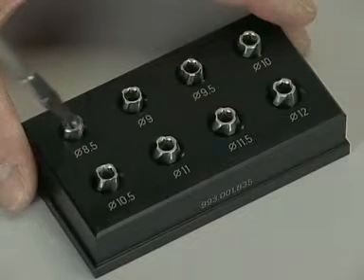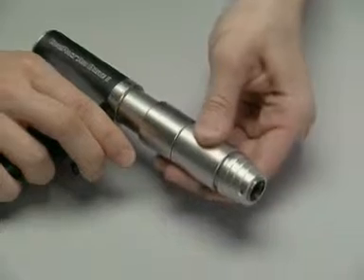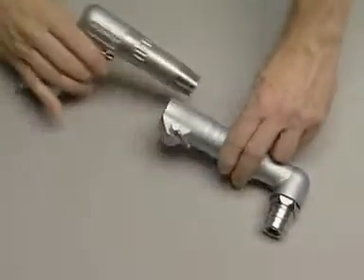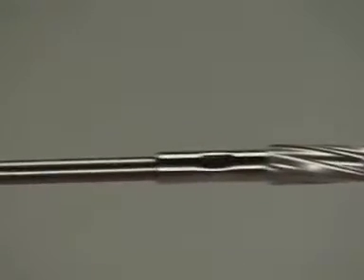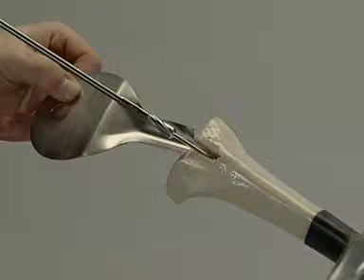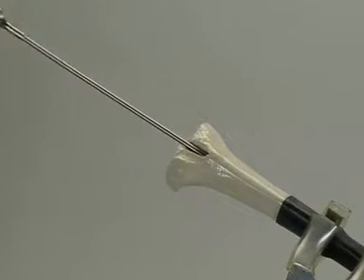The shaft can be easily connected to the reamer head by a click-on mechanism. The compact air drive with the attachment for medullary reaming is now employed. By pulling back the ring on the quick coupling, the attachment is opened and the flexible shaft can be inserted. The universal drill with the angular drive unit could be used instead. The flexible shaft is guided over the reaming rod. During the reaming process, the reaming rod is held precisely in the axis of the tibial shaft by the assistant, using the holding forceps to prevent the rod from rotating and the reamer from jamming. The reamer is pushed into the opening of the medullary canal without rotation. In practice, soft tissues are protected during the reaming by the tissue protector. Reaming is done using the highest drive speed with slight and even pressure, moving the drive back and forth. This movement frees the reamer from bone material and prevents it from jamming against the reaming rod.